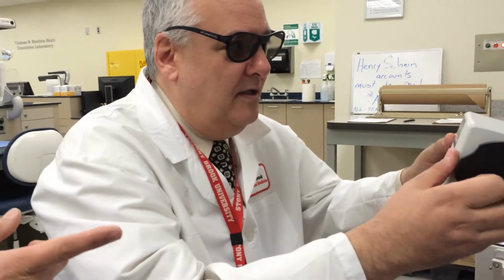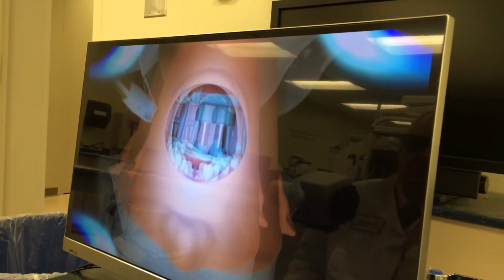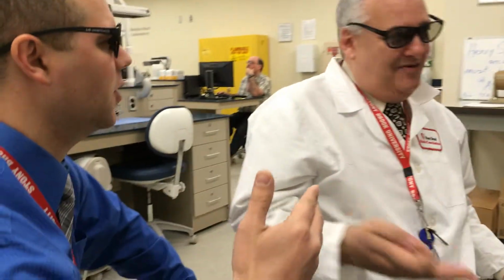And one of the cool things with this microscope, and that's a little bit different from our surgical operating microscope, is you can zoom all the way out. We never really get that view with our surgical operating microscope. We can never pan out that far. We're never really looking to be out that far. Would you want that different view? There are applications, like for a general practitioner or someone who's looking at the full arch. This zoom gives you that opportunity. Absolutely.